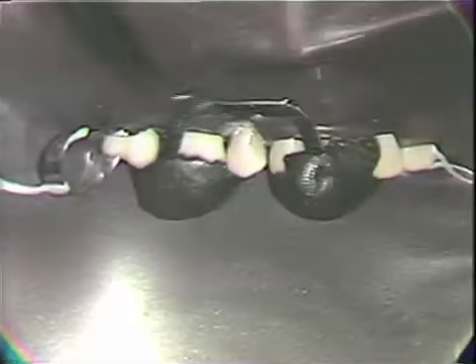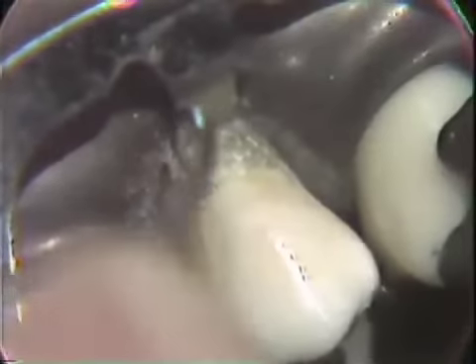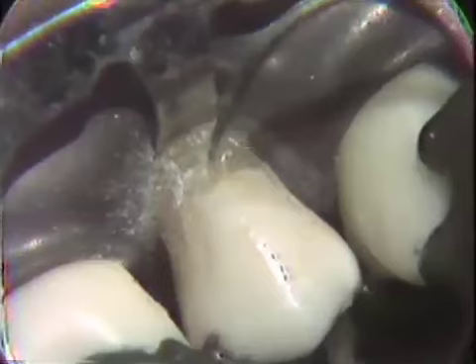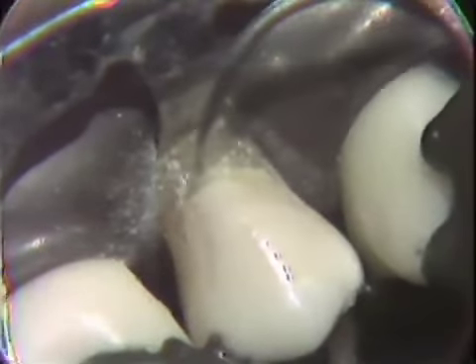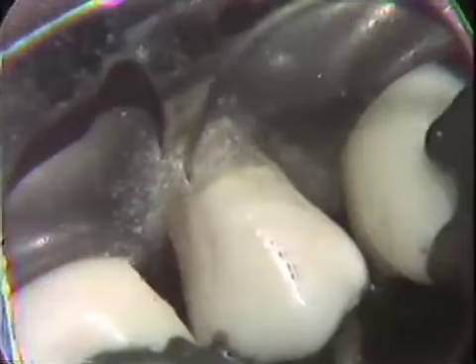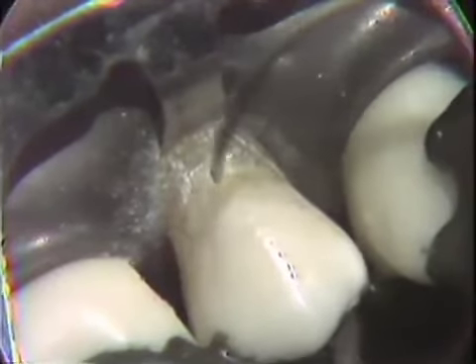All right, now let's look at the retentive form as far as testing with an explorer is concerned. We've got a continuous groove that runs across that area at the occlusal and in the cervical area. We have to do a bit more finishing, gain a little better smoothness on this distal wall of the preparation, and a little bit more at the cervical aspect.